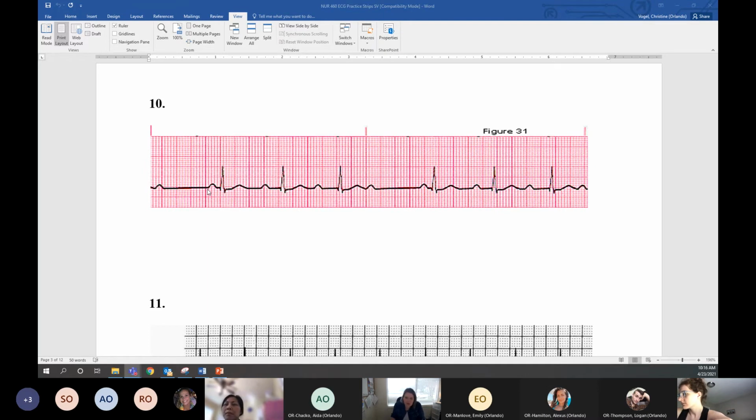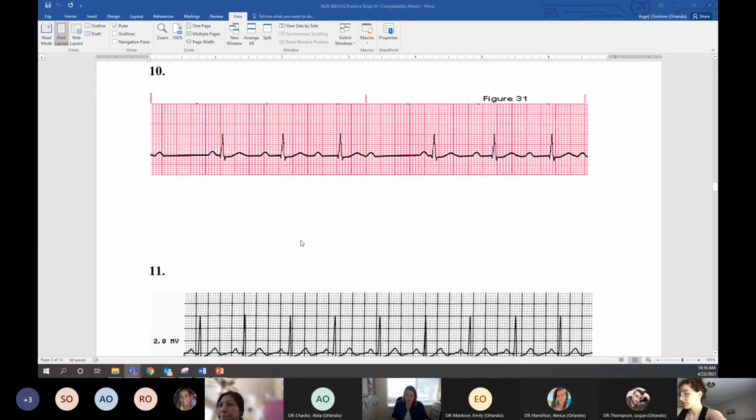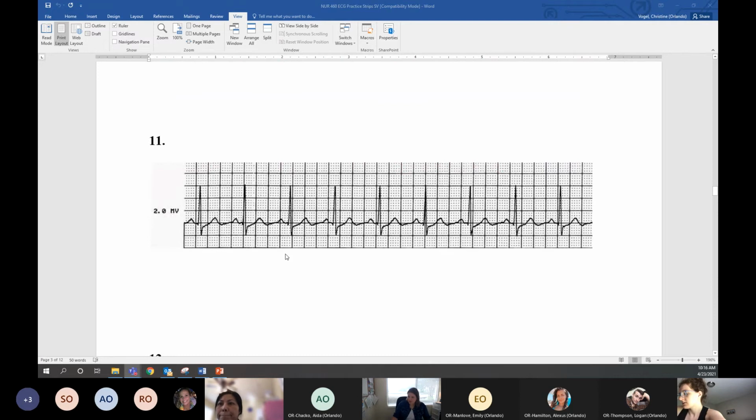Okay. So I'm going to start with my most normal beat, which happens to be this one. I see a P wave and a QRS. I'm so happy. And then I'm seeing a P wave, and then there's a longer one here, QRS, and then a T, and then a P wave, and then even longer, QRS, T, and then drop. So I have a, looks pretty decent, but then a longer drop. Now we have a Wenckebach. Wenckebach, second degree type 1. You got it. Does everyone see that? Do you need me to go over that one again? Okay. All right. Sometimes it is what it is.